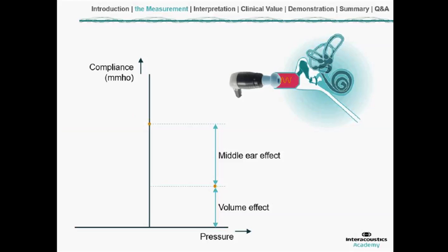Now I also need to introduce the frequency at which we do tympanometry. In the early days, they started using the frequency of 220 Hz. This frequency was quite randomly picked, not really random, but there was not a clinical reason for picking this frequency. It was chosen because microphones in the early days worked best around this frequency, so it was used for doing the measurement.